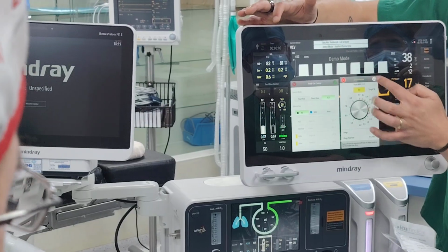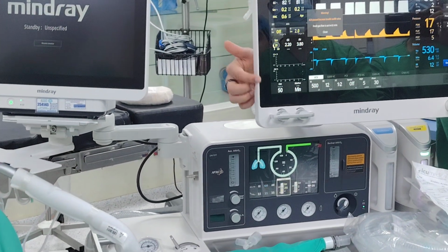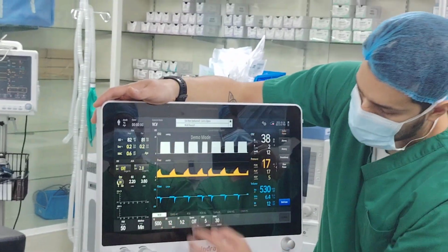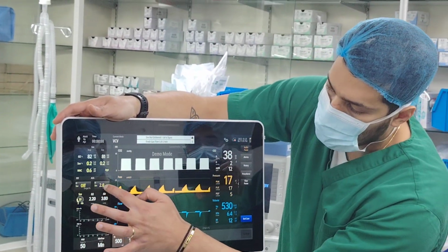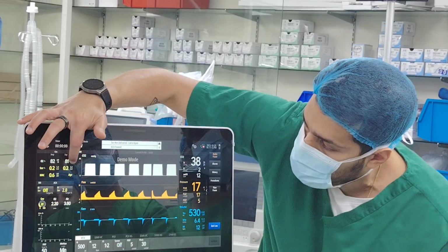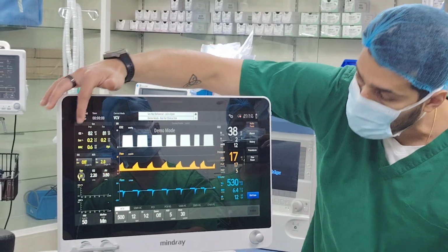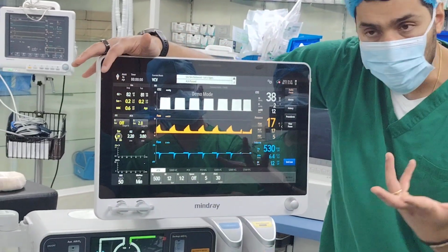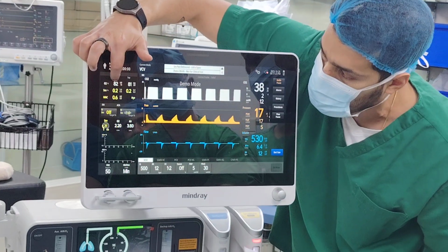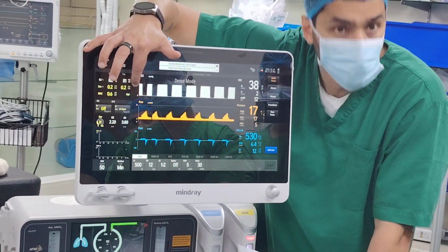What I do, confirm, look at the layout, how it changes now. Okay, so what does this mean right now? It means today your target is 2, meaning the machine will do whatever it takes to always reach 2. Forget about these numbers, they are fake now, it's a demo. Now your oxygen target is 50%, meaning the computer will always keep FiO2 at 50%. Your end-tidal is 2.